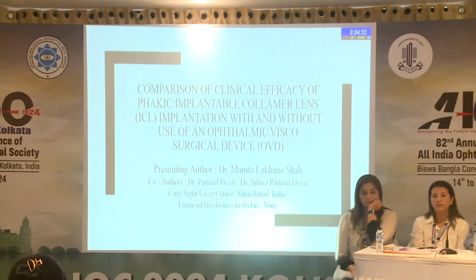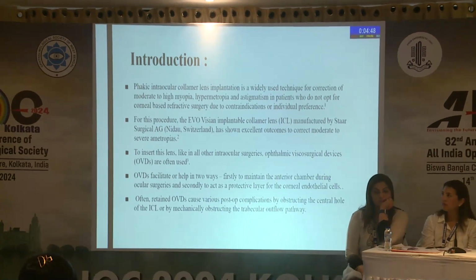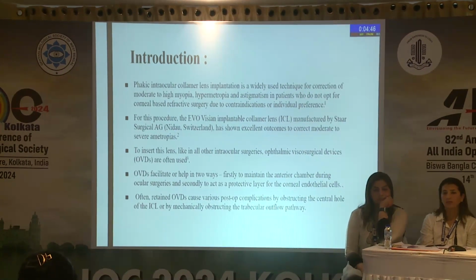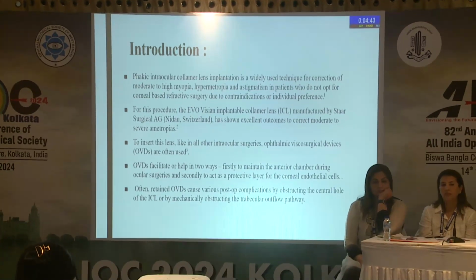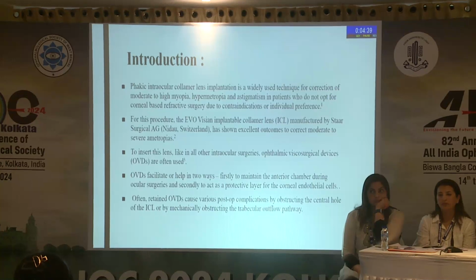Everybody. My topic for today is comparison of clinical efficacy of ICL implantation with and without use of an OVD. In introduction, I would like to say that phakic intraocular lens implantation is widely used for high myopia, even for hypermetropia and astigmatism. It is an FDA-approved technique.